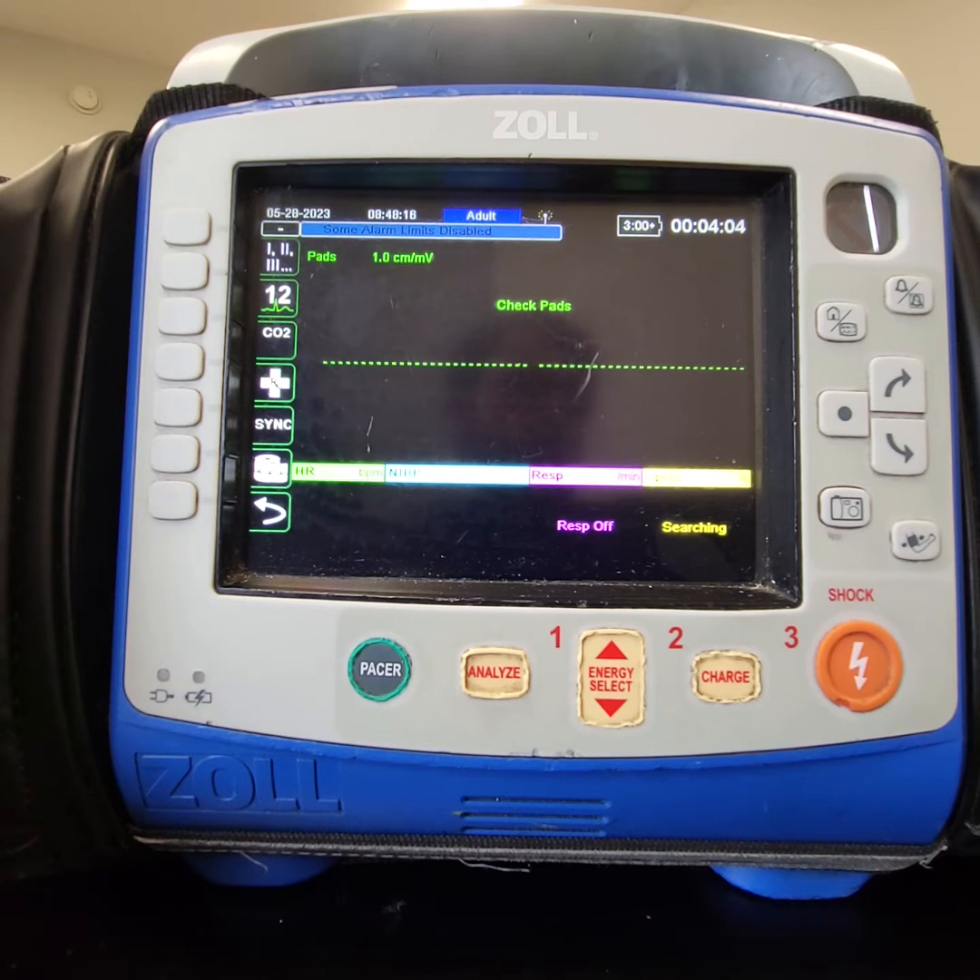Hey everyone, this is a quick in-service video on the use of our monitors in their AED modes with the new adult-child combo DFID pads that we've gotten from Medline.